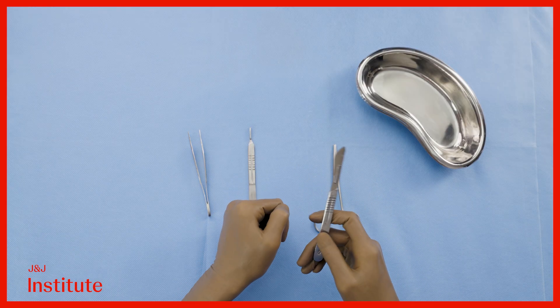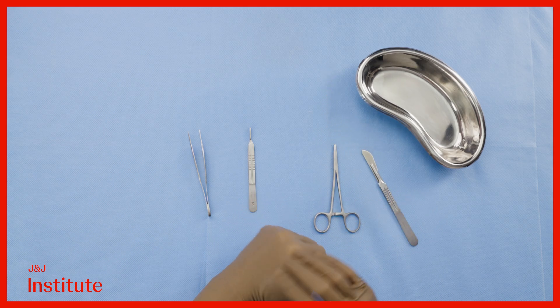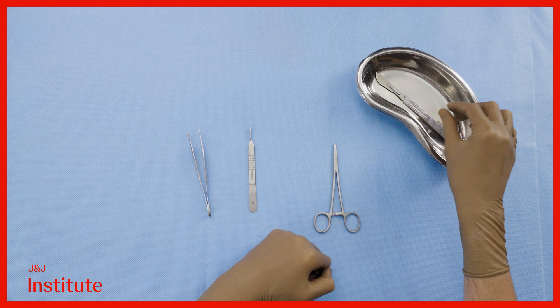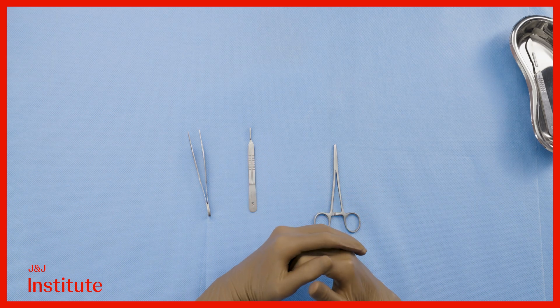When passing the scalpel to team members, never do so holding it in your hand and never place it loose within the surgical field. Always lay it down or pass it within a kidney tray to prevent injury to yourself and your team members.